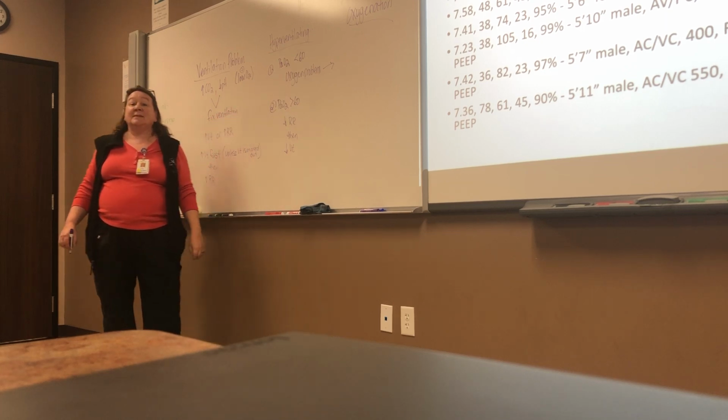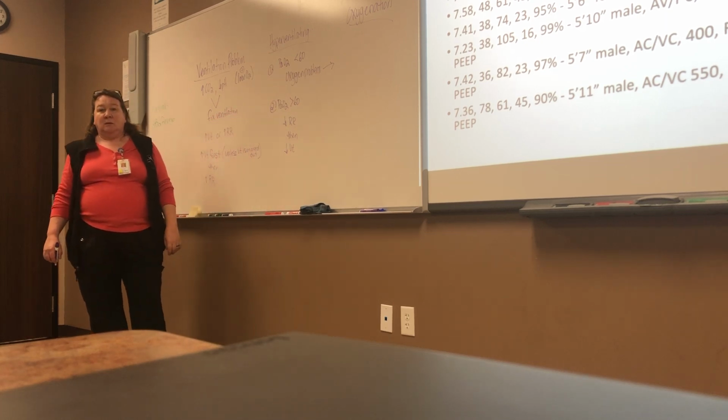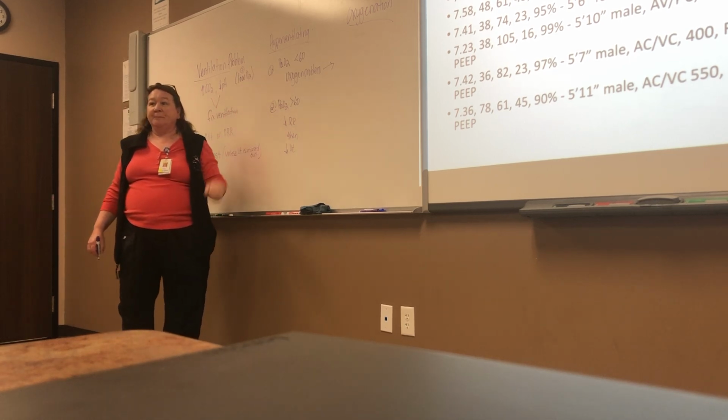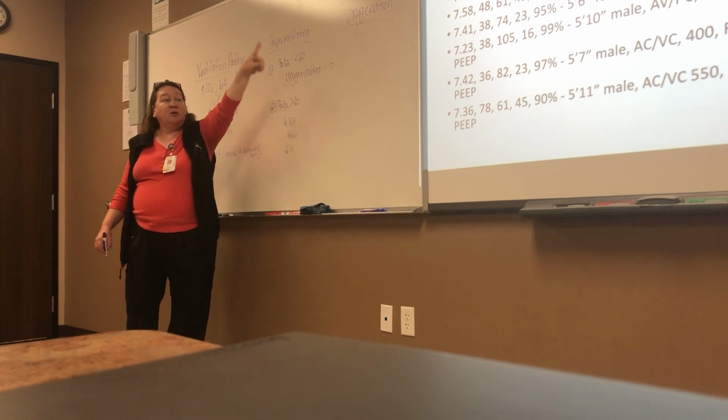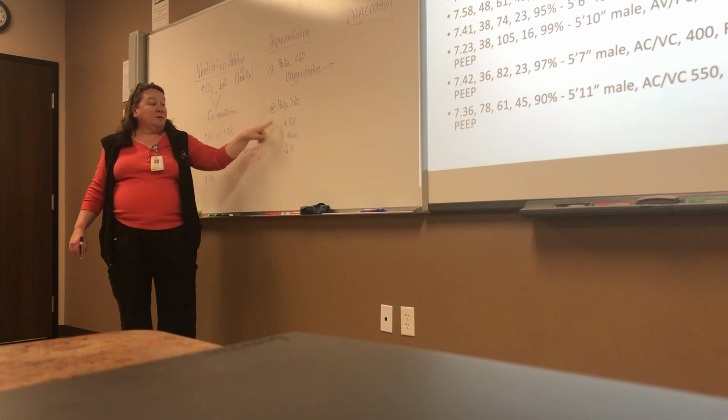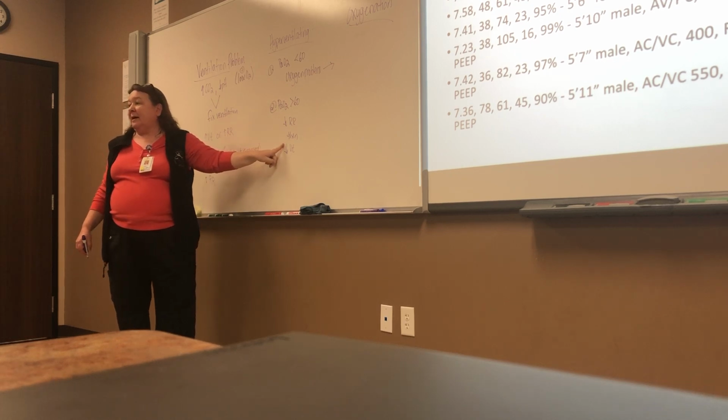If it's an oxygenation problem, in that case, we would only touch the oxygen. Correct. We would not do anything with the rate. Correct, because if you fix the oxygenation problem, you should fix the hyperventilation. So if it's an oxygen problem, you're going to the oxygen criteria. If it's not an oxygen problem, then you're overventilating them, and you're gonna go down on your rate.